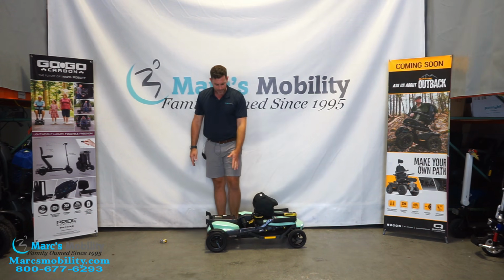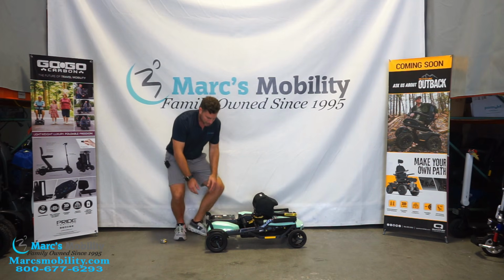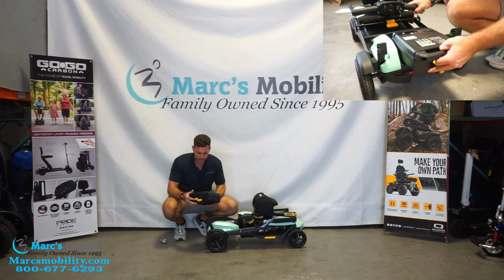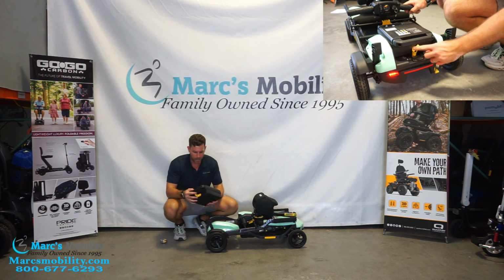Your travel bag can come off easily, and then your rear basket is just as simple. Turn the yellow knob to the side like this, and then you're able to pull the battery pack off.